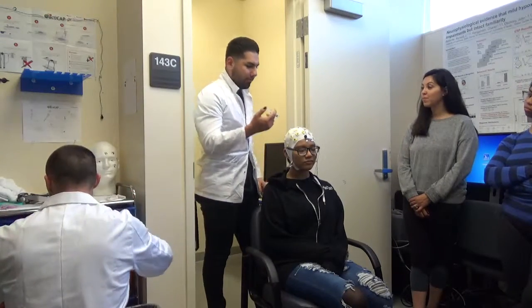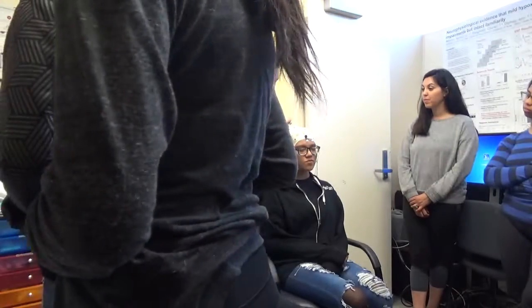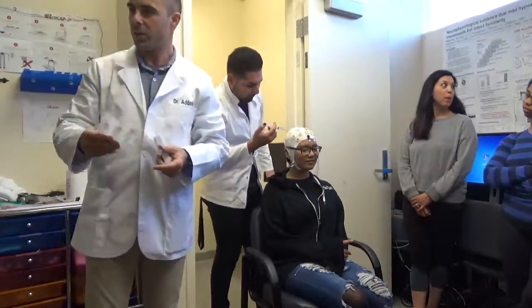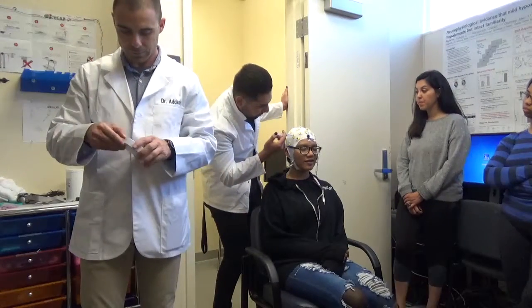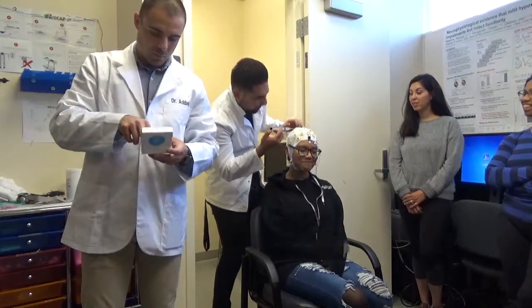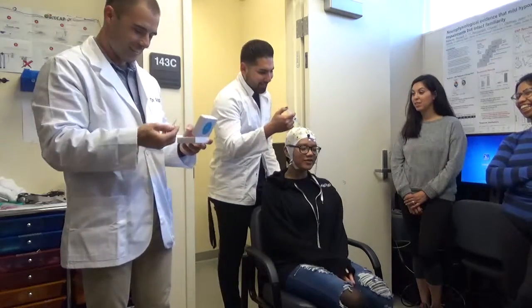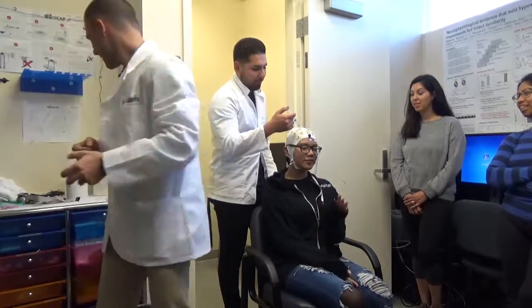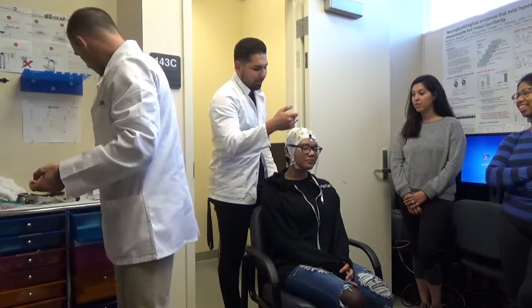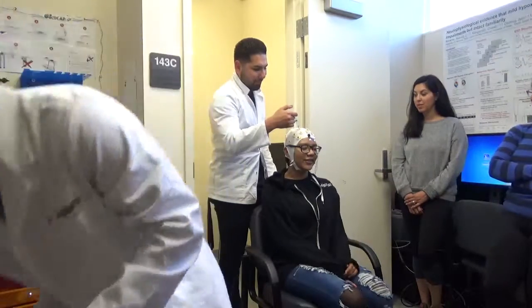You guys need one more to go. Yeah. Do you feel each one? What's that? Nothing has gotten in yet. Oh, you wanna help? Oh, yeah, open those up. Make sure you massage it around. I don't think I'm qualified for that. For what? Just don't apply too much pressure, that's all. It's not stabbing me. Just minimal pressure. Do you feel that? So, where's the other two? You should feel it. Don't be scared. And, let's see. I can get another one.